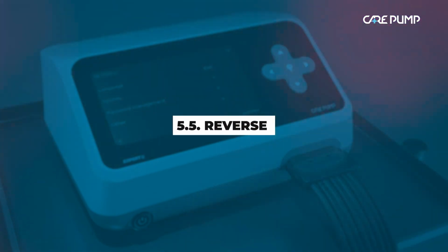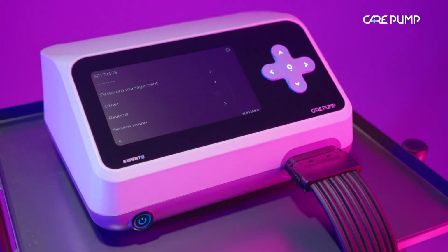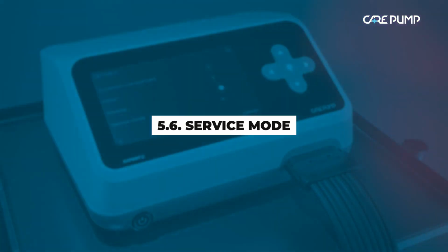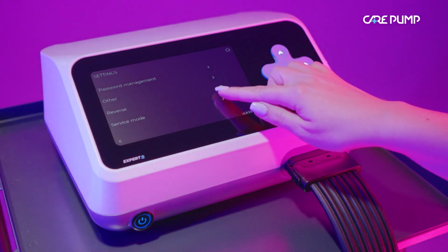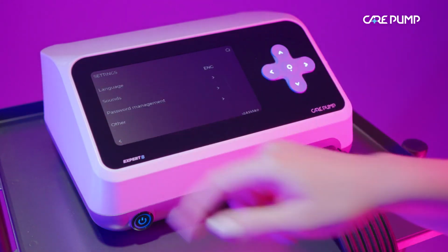Reverse mode. Reverse mode allows setting the inflating of the chambers in the opposite direction, from the last chamber to the first one. When this option is activated, any selected work mode will inflate in the distal direction. Service mode. Service mode is an option protected with a password available only for the authorized service personnel.